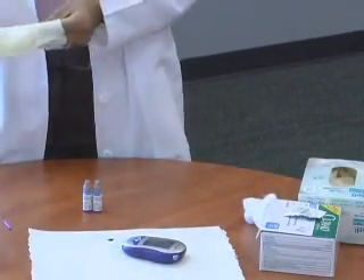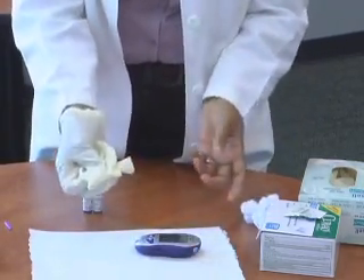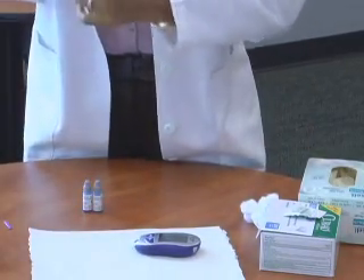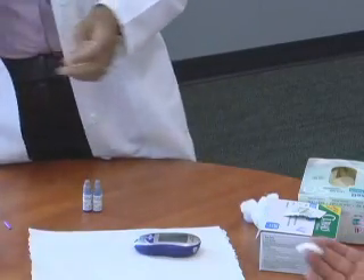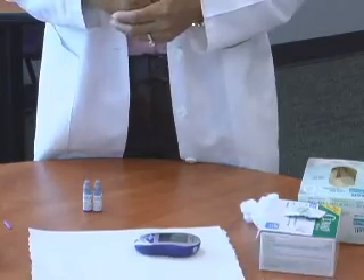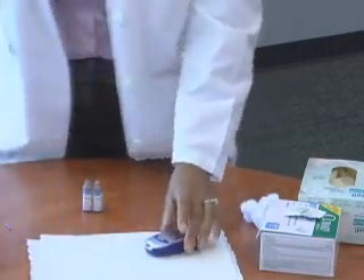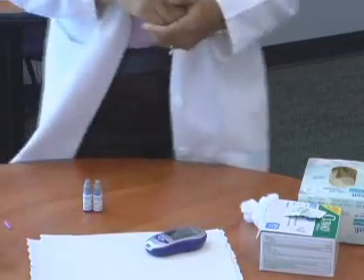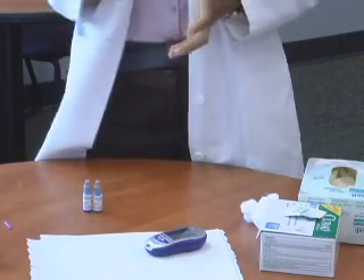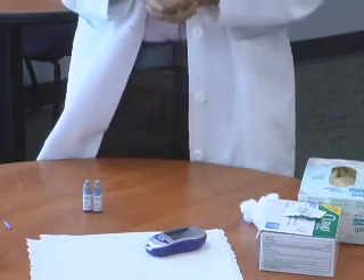Remove the strip with your gloves on and throw it away in the trash can. The patient can also throw away the alcohol swab directly into the trash can. Then you are ready to write the patient's blood glucose results on their blood glucose results form, give it to them, and explain it to them.